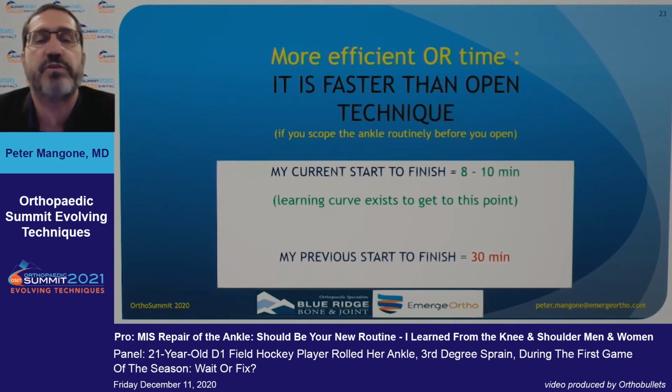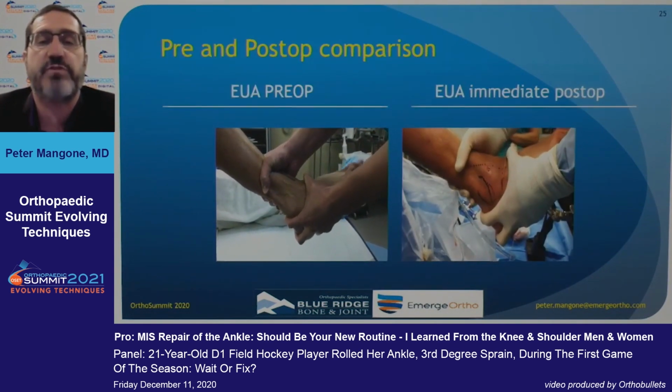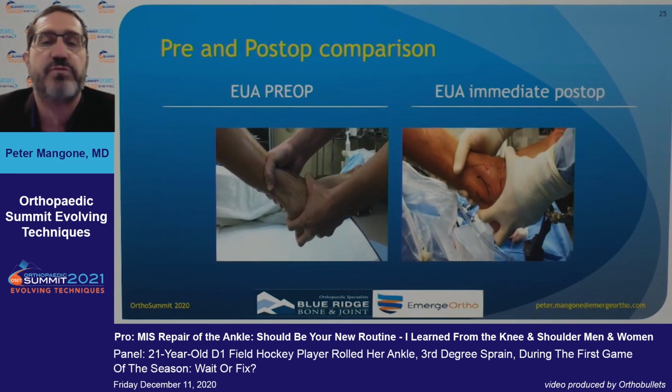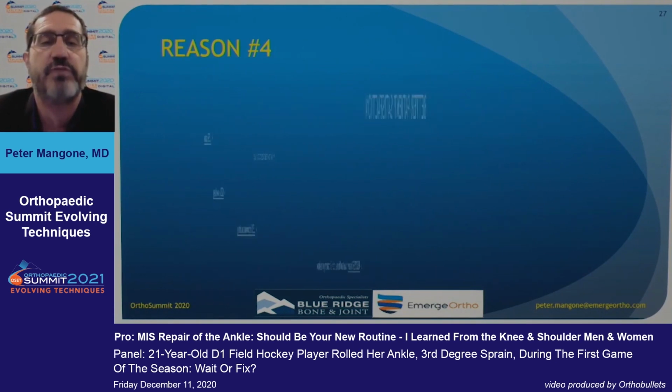There's obviously a learning curve with this, but my previous time between scoping and then taking it down, doing the opening, the incision, closing the incision in layers, et cetera, takes about 25 to 30 minutes. And you get excellent results in the operating room, substantial improvements in your instability, and you can see this arthroscopically while you're looking at it. So you can actually know for sure that you've got things tight and they're not overtightened.